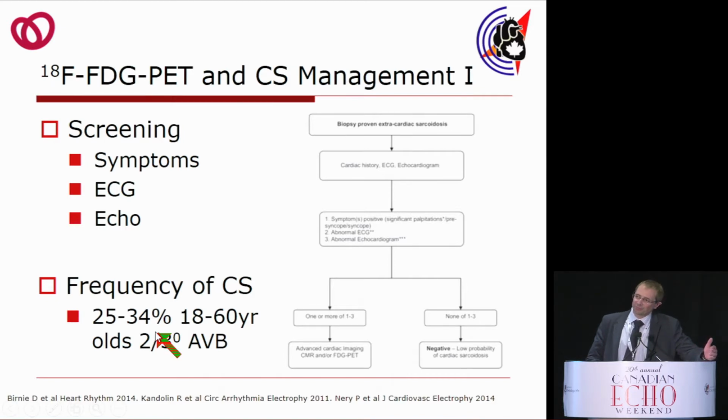So, we can pick it up, but how does it help management? So this is the how. How does FDG help in the management of sarcoid? So we can help with the etiology in young patients with complete heart block.